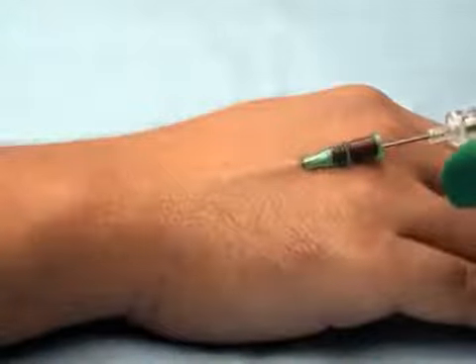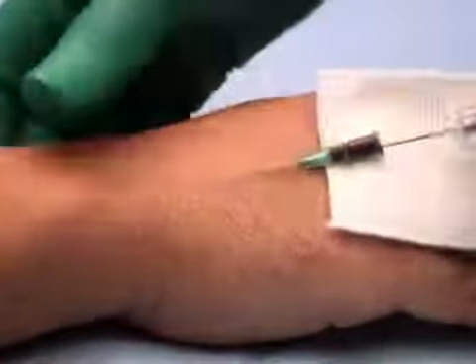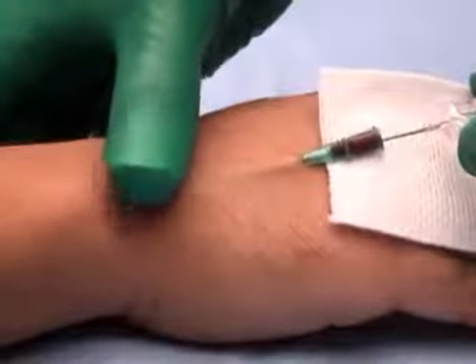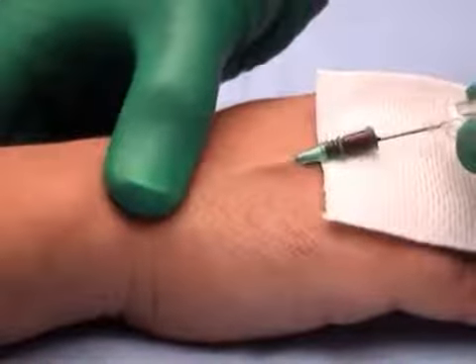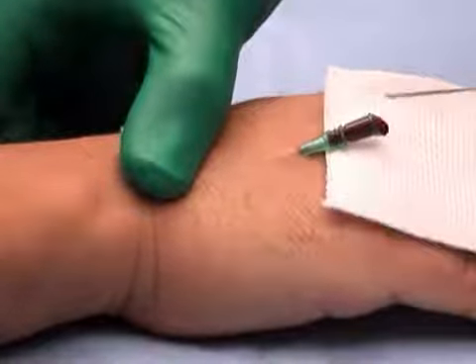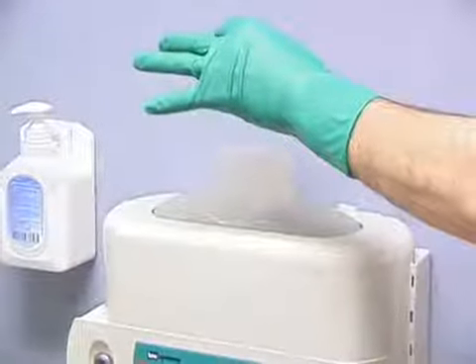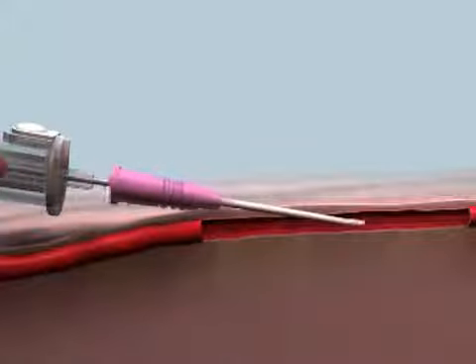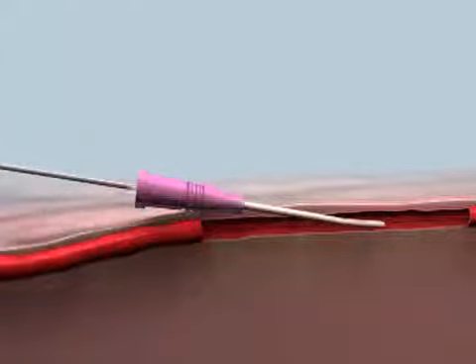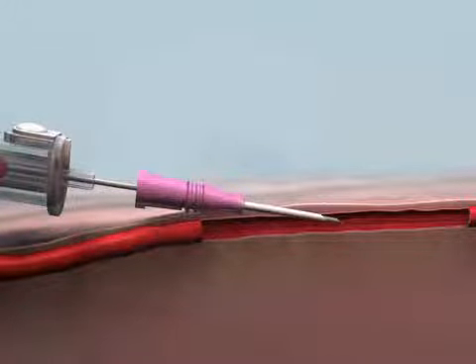To prevent blood loss from the open plastic cannula hub when the metal needle is removed, place direct pressure over the vein proximal to the end of the catheter and place a gauze pad beneath the cannula hub. Remove the metal needle from the plastic cannula and place it in the sharps container. Never attempt to reinsert the metal needle into the plastic cannula. Doing so may shear off the plastic cannula, releasing it into the bloodstream, resulting in a possible embolus.